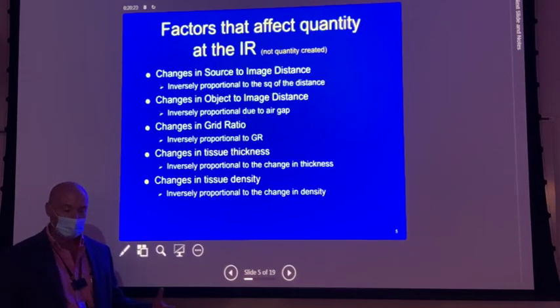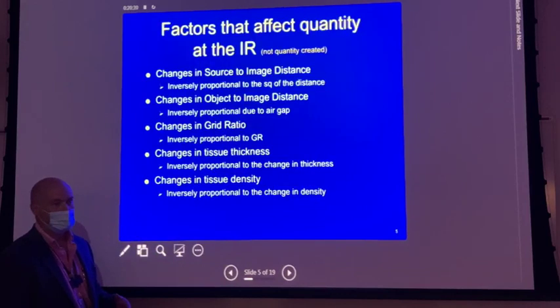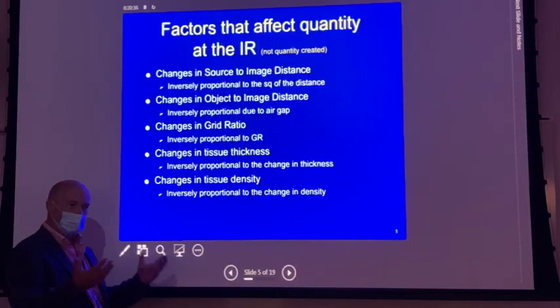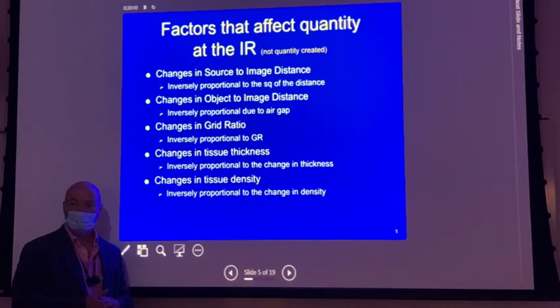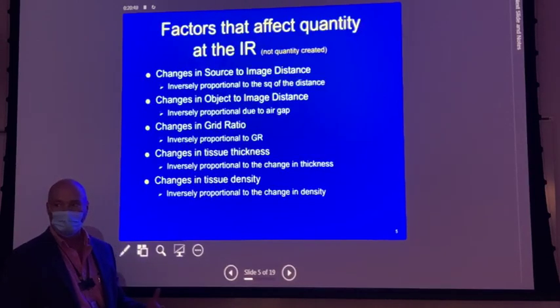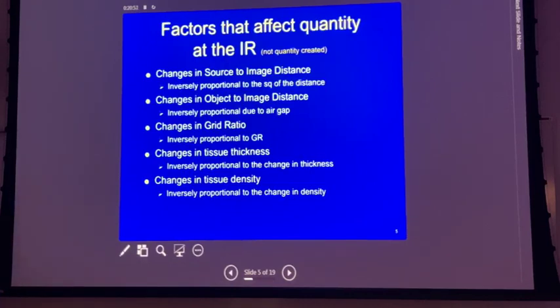As opposed to the other patient who is really big and bloated because they've got a bowel obstruction. What's your telltale sign that the patient has bowel obstruction? Air. Air, right. So, do you think you're gonna see a difference in the image between those two patients? The patient with the air is gonna appear dark, as opposed to the patient with the ascites, who is gonna appear very gray, right? So, a lot to consider in tissue thickness and tissue density there.